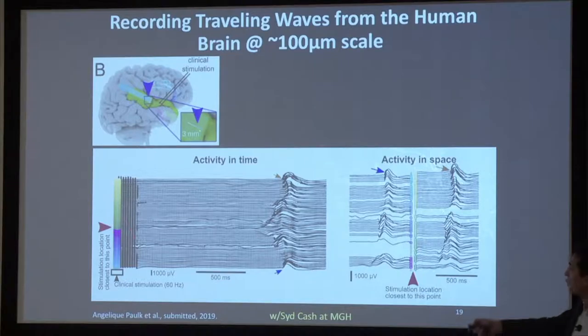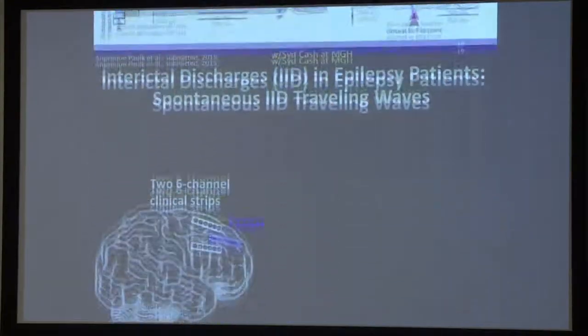And we can see from the cumulative plot from all channels that at about 1.5 seconds into the recording, we see an eruption of waves of local field potentials. If we plot that spatially on the two grids, we see that the wave propagates closer to the stimulation site up to the top of the array. There are changes not only in the temporal signature of these waves, but also in their amplitude on distances of about 100 to 200 microns.